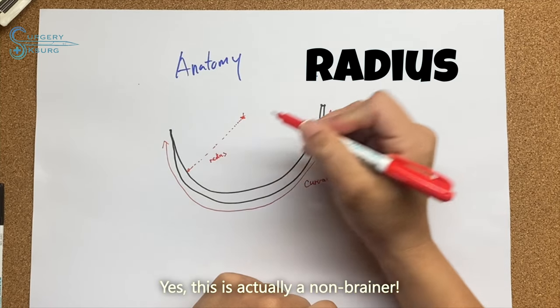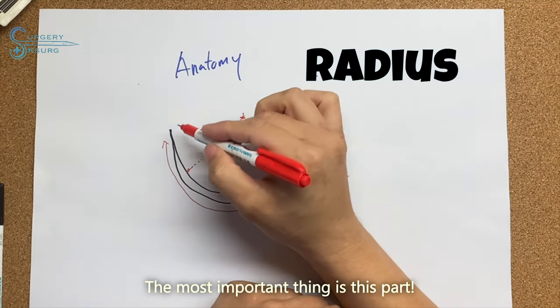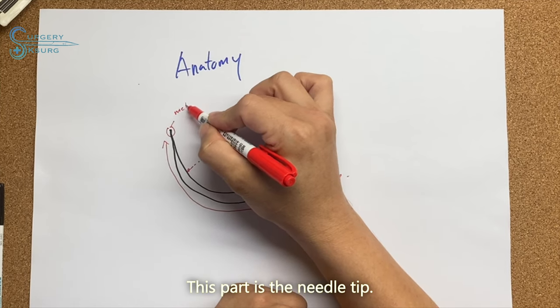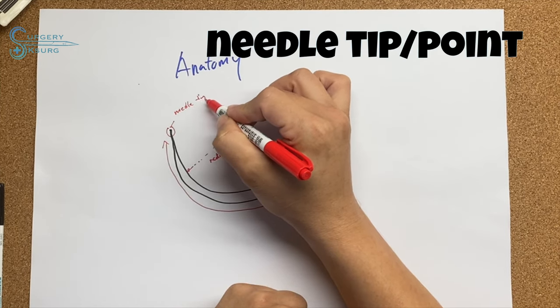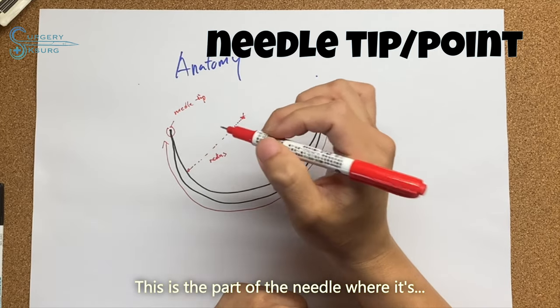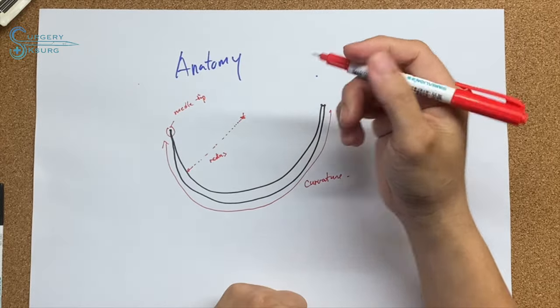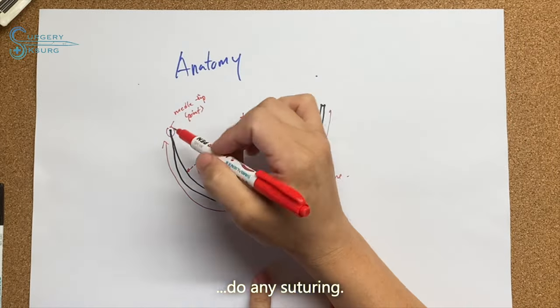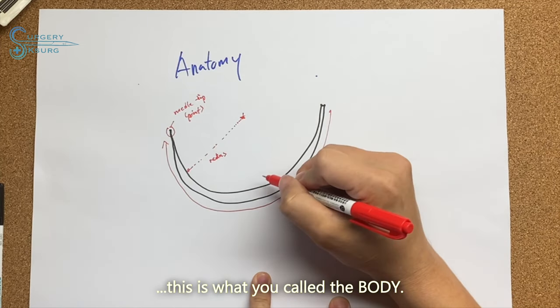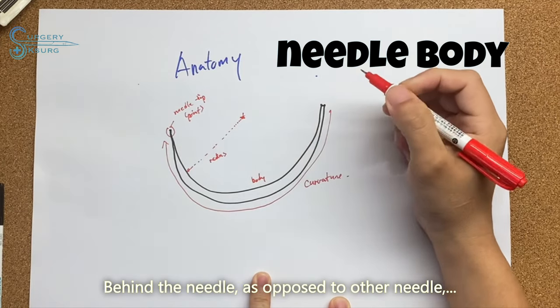This is actually a no-brainer, right? This is the needle radius. But the most important thing is this part. This part is the needle tip. This is the part of the needle where we make the first contact with the tissue that you want to suture. From the needle tip we come down. This is called the body. The needle body.